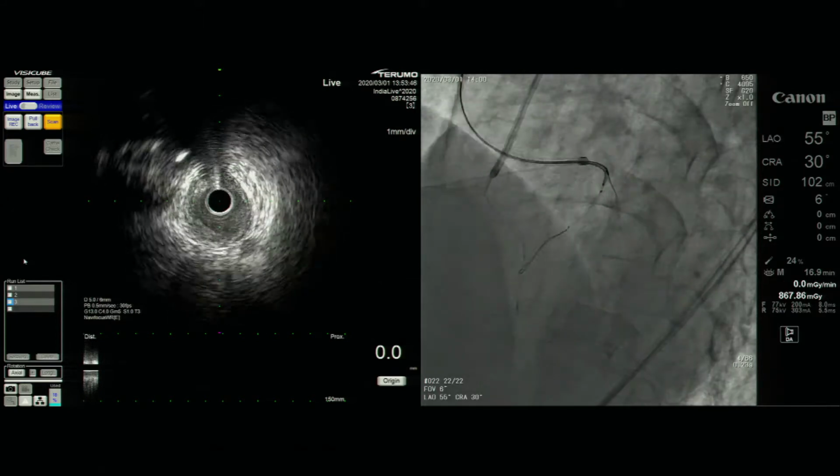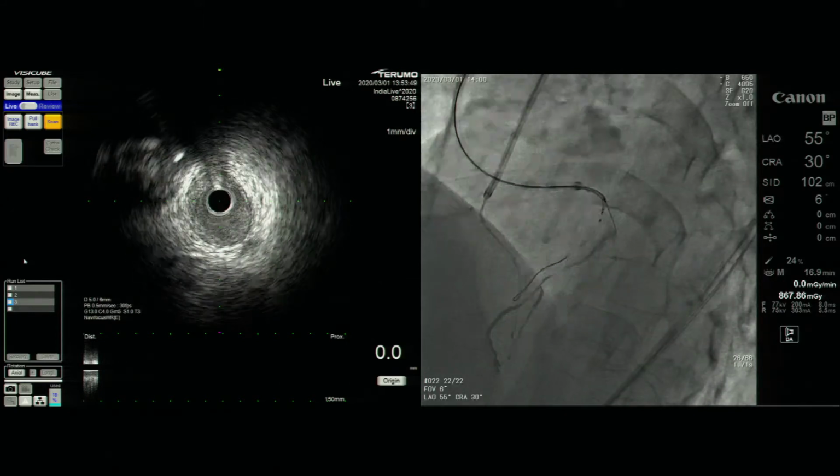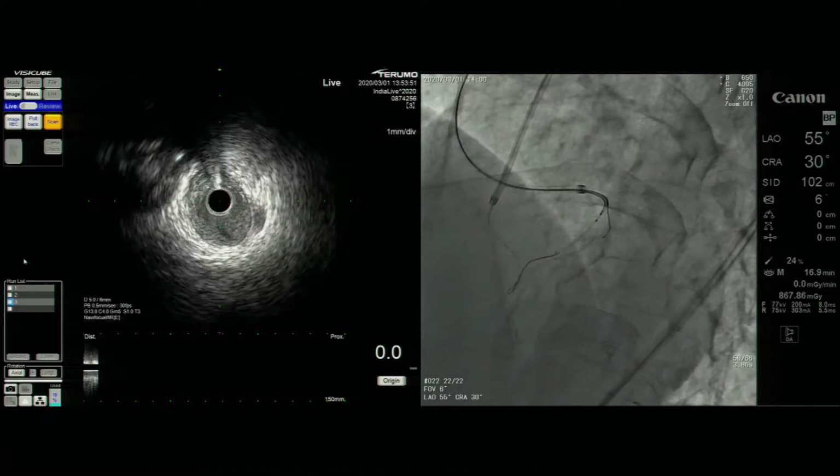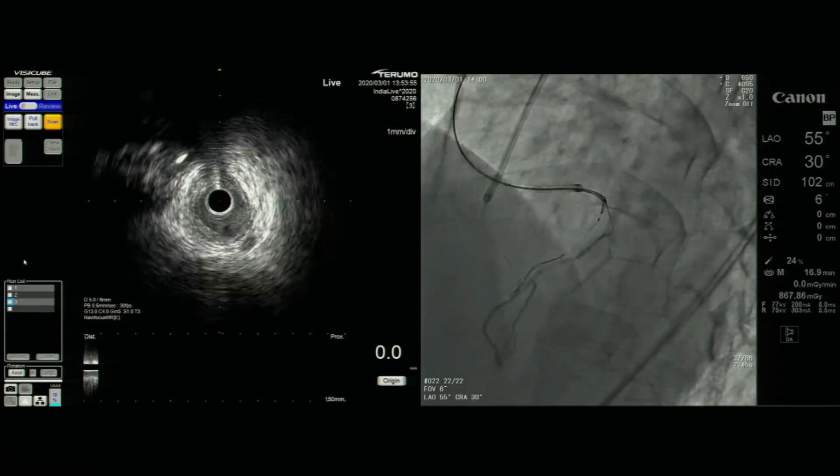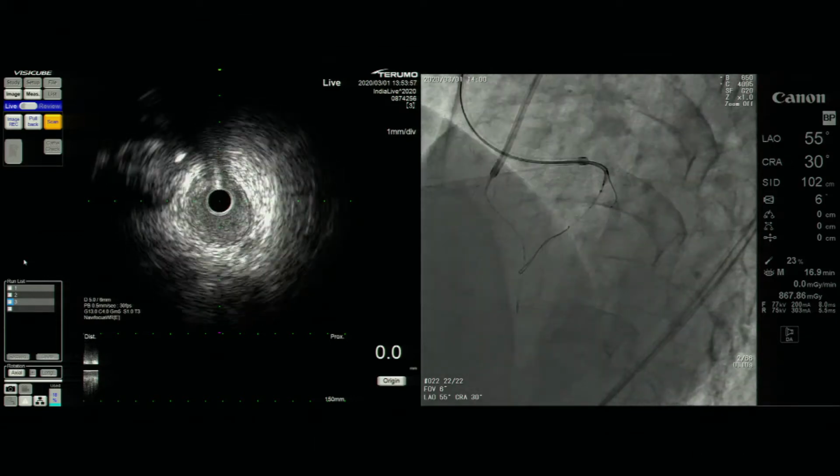Even from the CT, the distal cap looked very blunt also. So it may be difficult to get entry, but we don't know. Only a small streak was getting up the bifurcation.